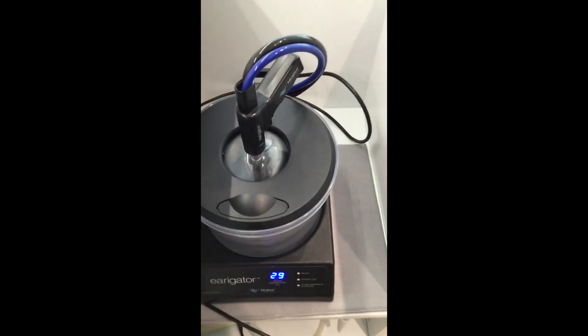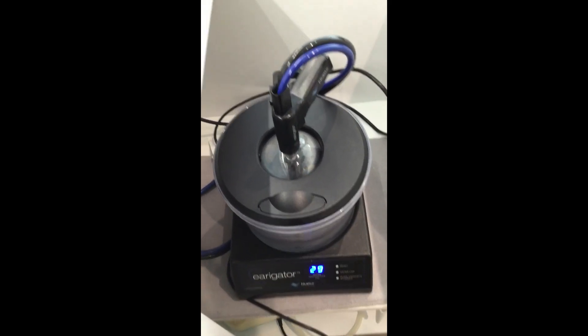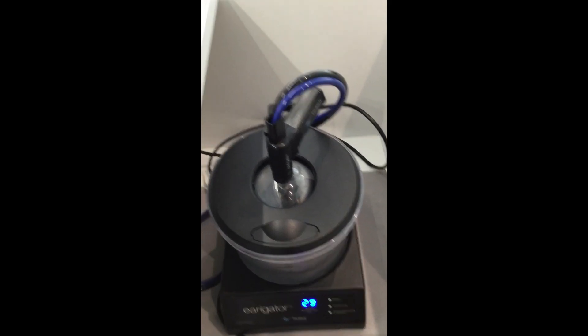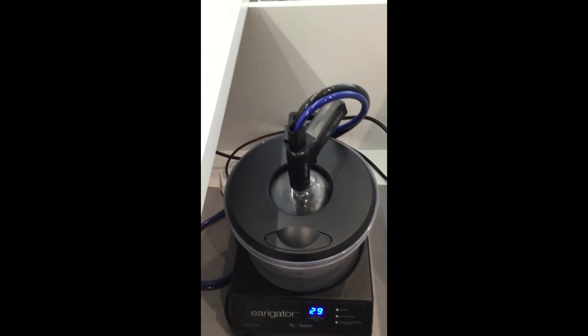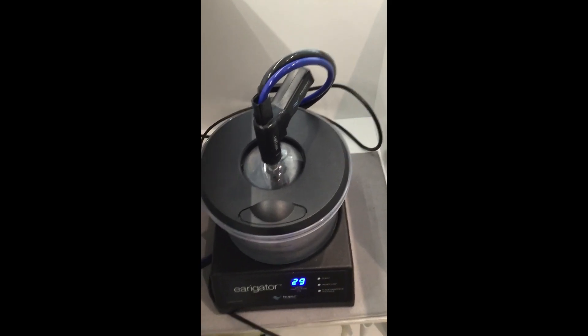We've just turned on our irrigator and what we're doing is we're waiting for it to get up to body temperature, so it's between 36 and 38 degrees. This is basically to make sure that your body is more comfortable and you don't get dizzy when we take the wax out.